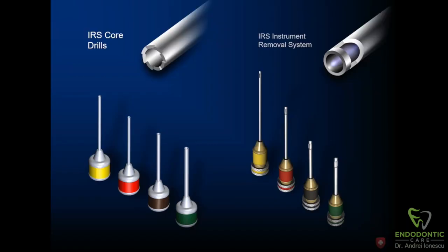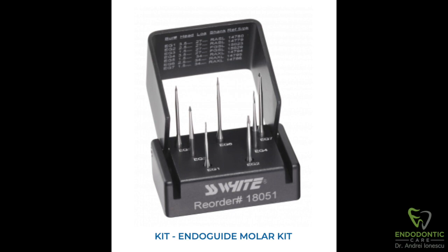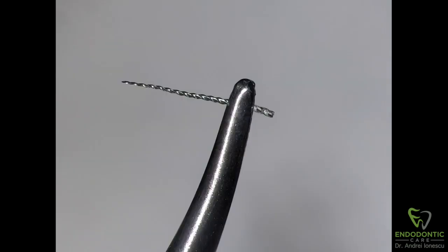With the help of the San Diego Swiss Instrument Removal System (IRS system), I was able to remove this file without too much trouble and completed the case. I also used some pretty interesting burrs from SS White. They have a series of burrs called EndoGuide, which helped trough around the file so I could capture it with the IRS.